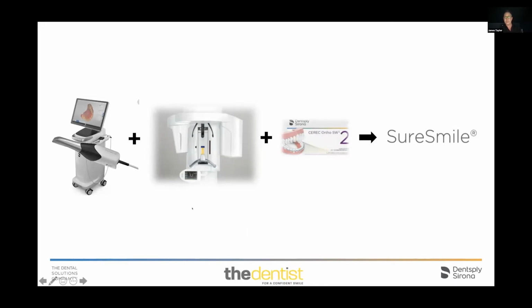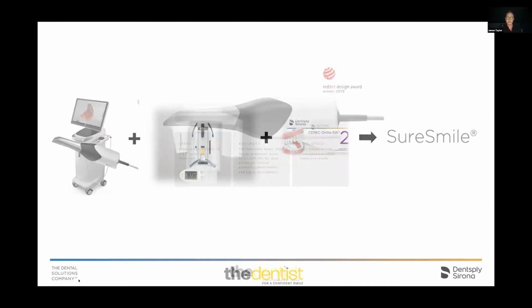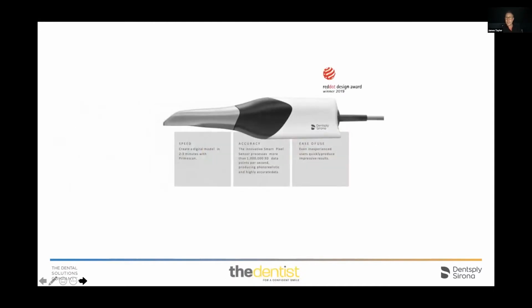That then goes into something called CEREC Ortho, which is the software linked to the Dentsply system. And then that in turn moves into the SureSmile software and allows us to design the aligners and then get them fabricated and fit. There's going to be more conversation after me about the actual Primescan. But like I said, we used Omnicam initially. The new Primescan, which has been out for a year or two, is brilliant, very quick, very efficient. And the scan is great. That'll be discussed a bit more later on with another speaker.